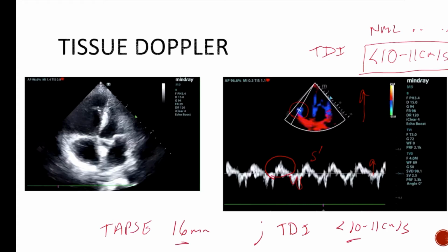Okay. The same thing happens here. If you have an inferior wall myocardial infarction or something that's tethering that free wall, you're going to see decreased function when it may not actually mean that the patient has global decreased RV systolic function. Now, someone that has an inferior wall MI, very likely they're going to have decreased RV function, but it's important to look at the whole picture.